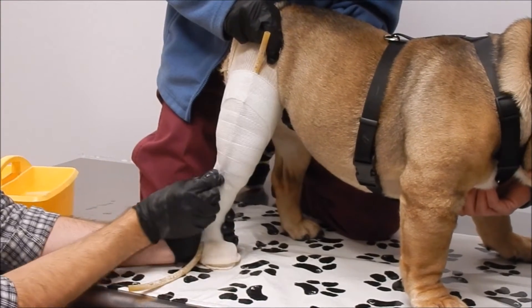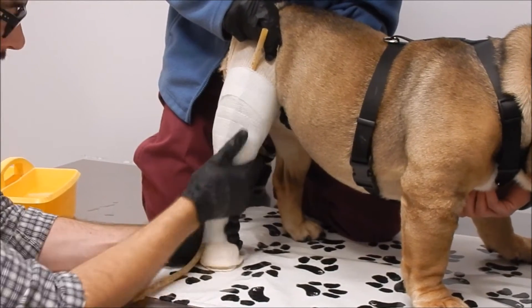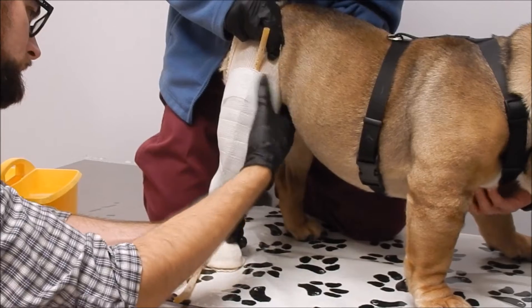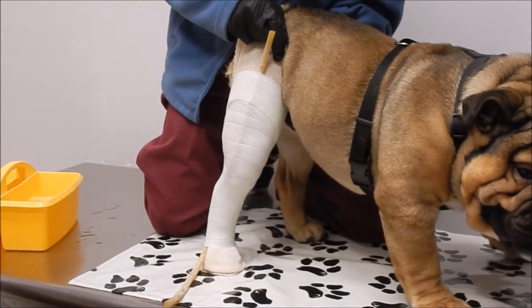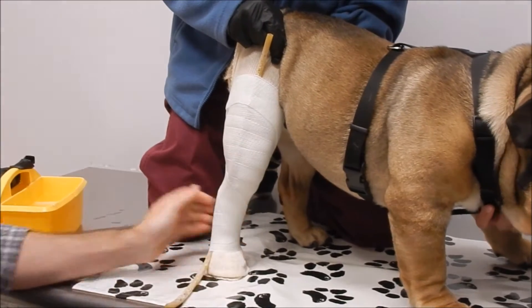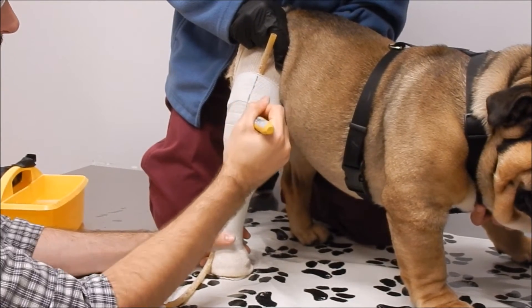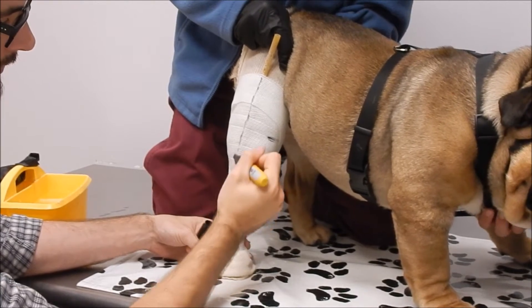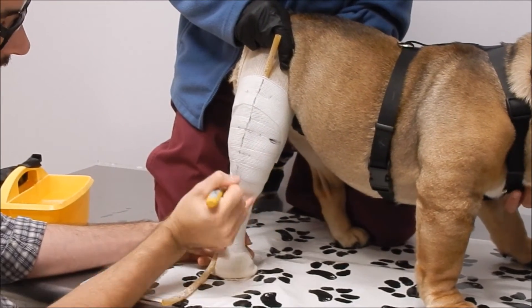I'm delineating the tube so I know how to cut it off. It's starting to firm up a little bit so I can take my Sharpie. I'm going to mark the patellar tendon and then follow my tube so I know how to cut without cutting anything that I don't want to cut. My marker doesn't mark the greatest, but it's enough to give me a good guide.